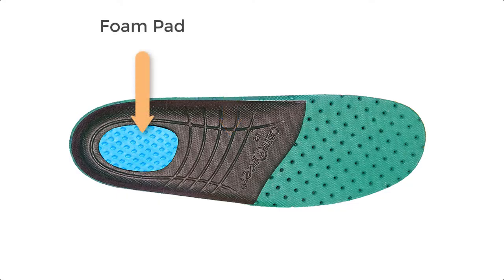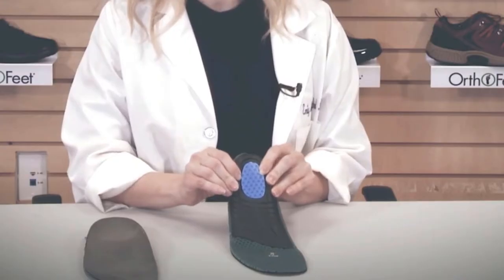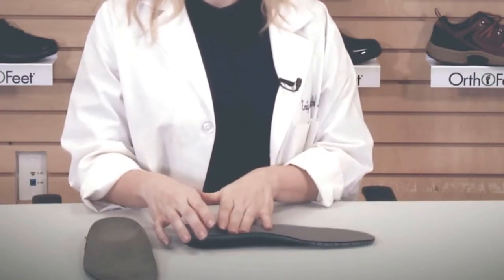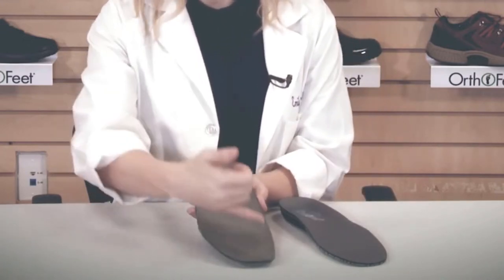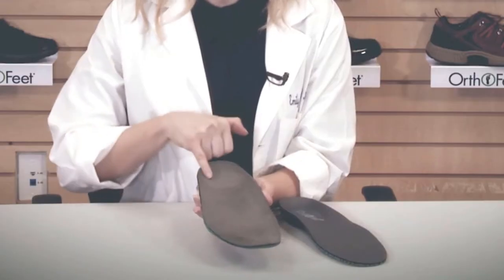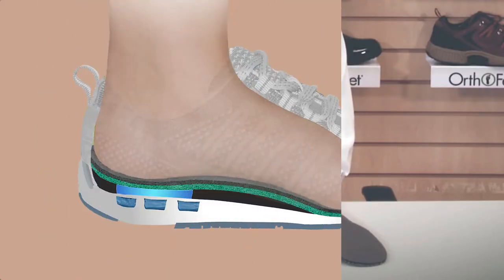The heel pad provides cushion in the heel, as well as a trampoline effect to absorb impact forces. In addition, the insole accommodates to your foot shape, so with every step that you take, the OrthoFeet insole will actually conform and shape to your unique foot shape. You can see on the back that you start to get this deep heel seat that provides increased cushion and control.